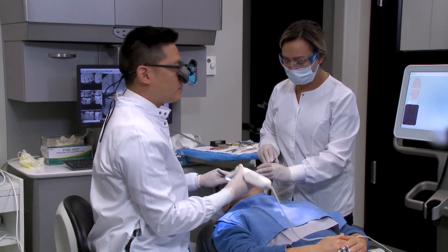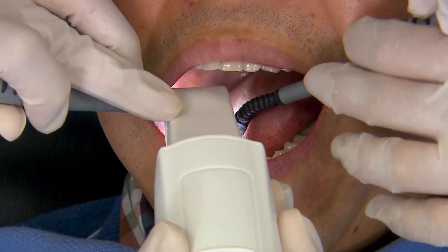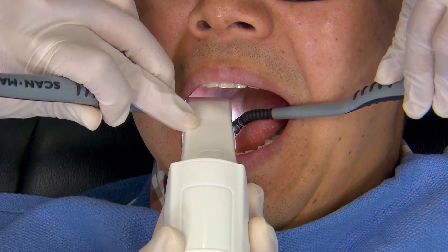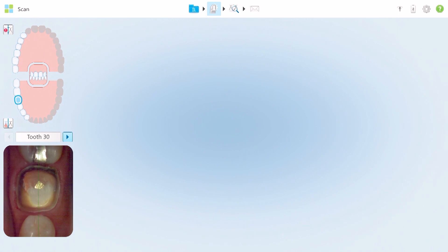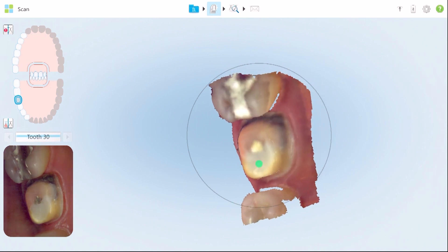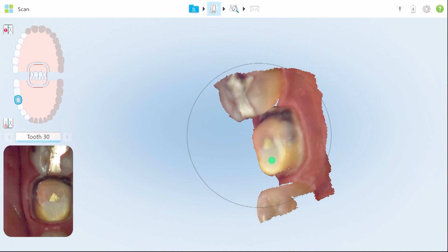This first scan will be of the preparation. With the iTero Element, you're going to rest the camera down on the teeth — you can see the crosshairs there. I start off on the occlusal, then once I activate the camera with the button on the body, I begin rotating to the lingual. It's almost a hard rotation to 90 degrees.